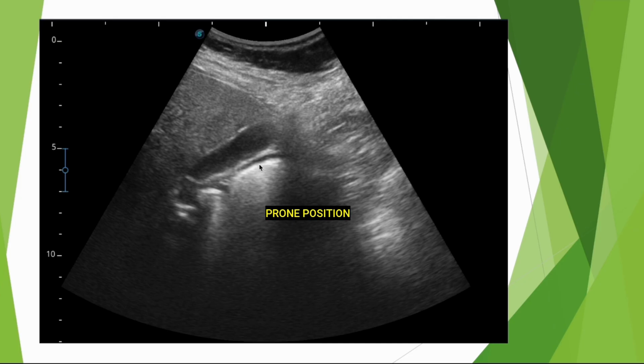Here, there's absolutely no question of there being two images inside the gallbladder anymore. We can see very clearly that our gallbladder wall is here, and our images are separated by the digestive wall. Here, we can see the digestive wall, and these two images, highly echogenic with an impure shadow cone, are outside the gallbladder. They're actually inside the digestive tract. That makes perfect sense then.